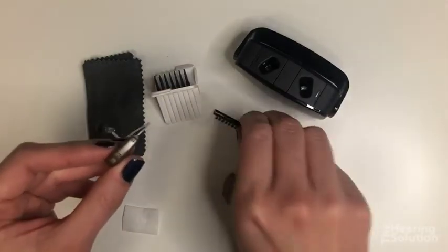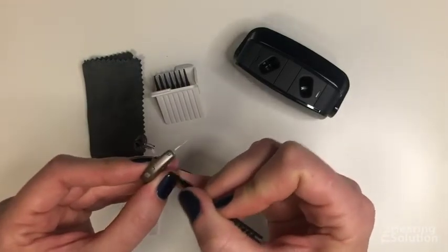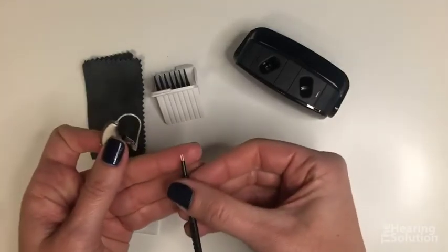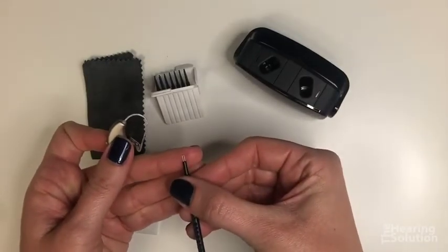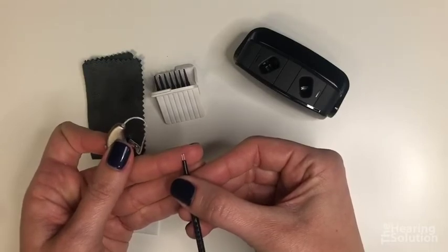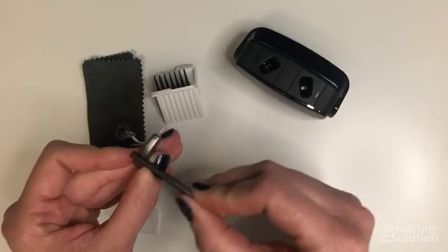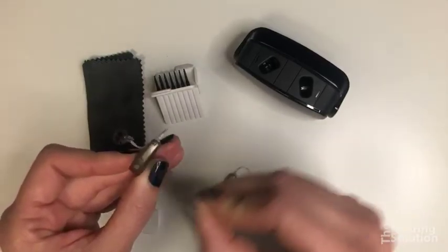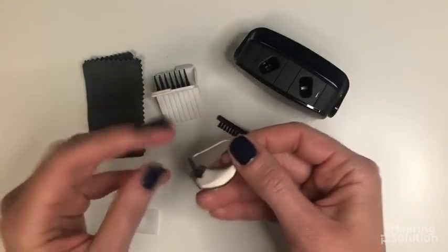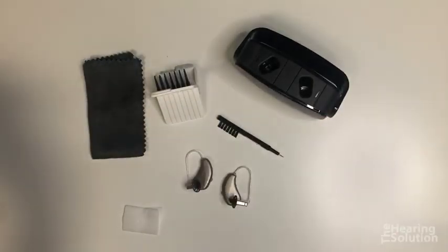The last step is to clean your microphones — those are the two little holes on the top of the hearing aid. On your brush, one side is a wire loop meant for a different style of hearing aid, so you can ignore that. Just use the brush and scrub the top pretty firmly; they're very durable and you won't hurt them. And that's how you clean your Widex Moment hearing aids.